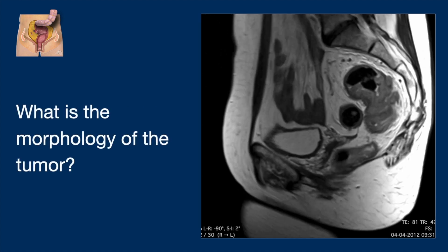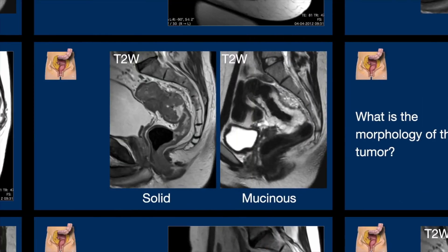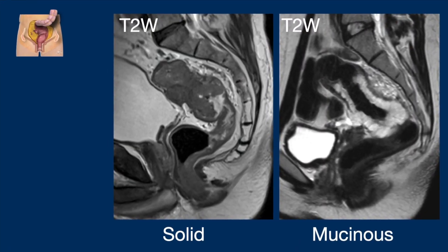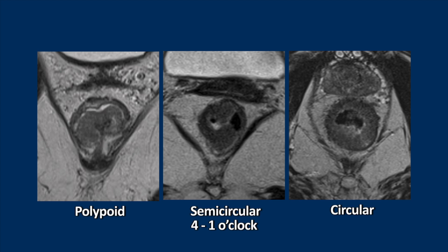What is the morphology of this tumor? Looking at two other cases: on the left we have an iso-intense tumor on T2-weighted images, which is solid. On the right we have a high signal tumor, which is mucinous. Then we have to look at the shape of the tumor. The tumor can be polypoid, like the case on the left where we see the lumen and the stalk. Or a tumor can be semicircular or circular, like the two other cases.